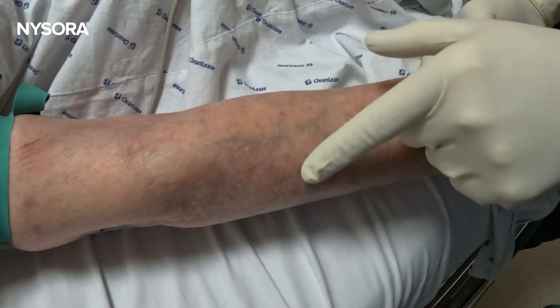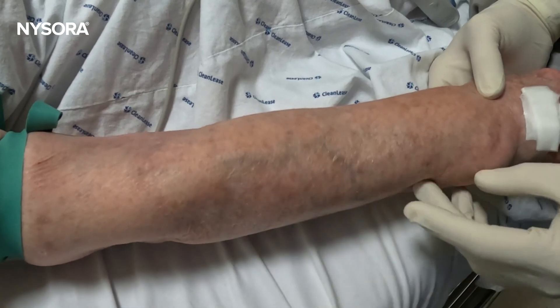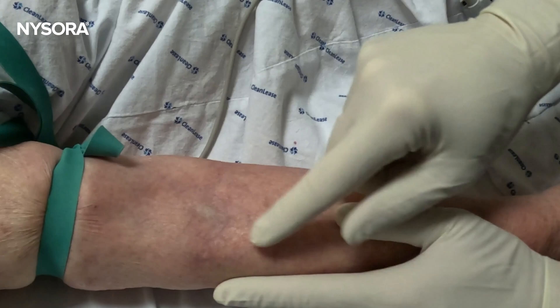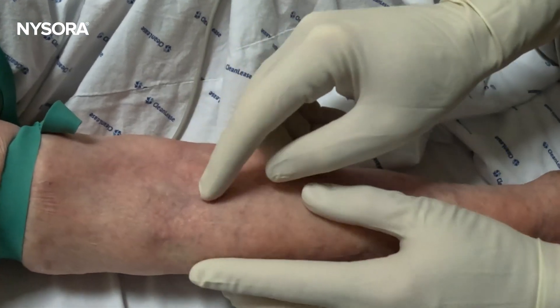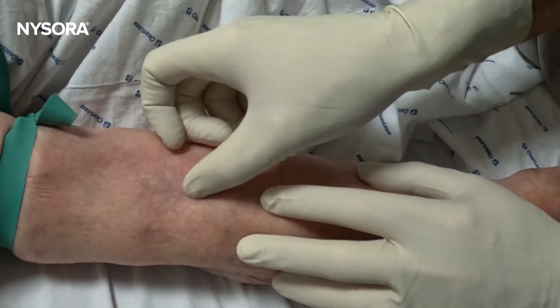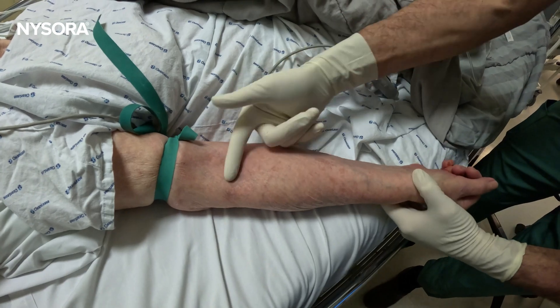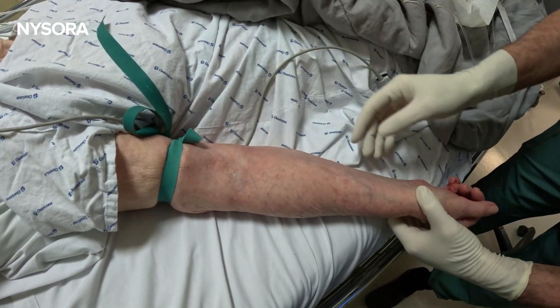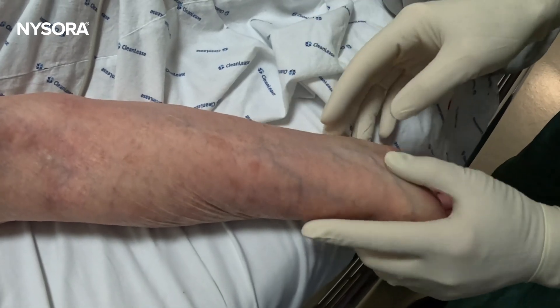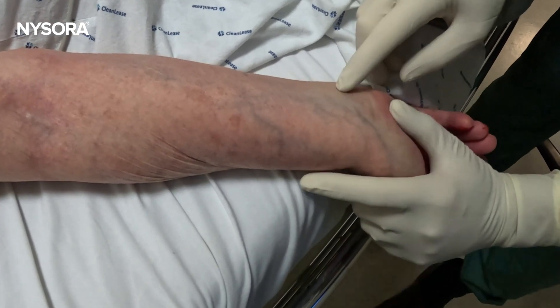Besides, this vein also has a tortuous course — it wants to go to the left, so it doesn't have a straight path. So we're going to look at what else we have. There's one vein over here; we can clearly see it, and that would be a good choice for intravenous cannulation. Unfortunately, the veins in the antecubital area are not the best choice because when the patient bends the arm, the catheter tends to kink. These are additional options, but again, very tortuous veins — really difficult to place the catheter and maintain them.